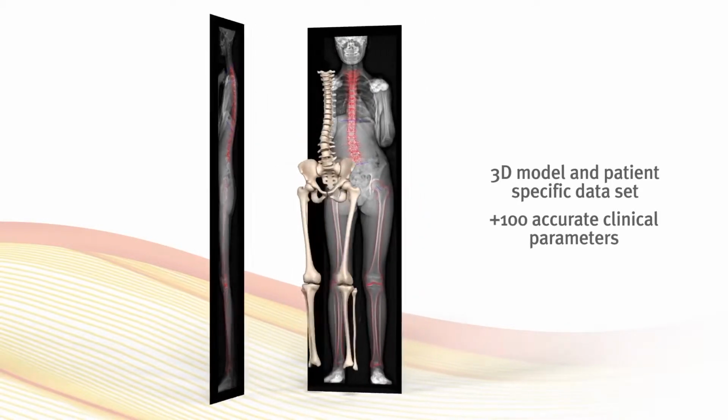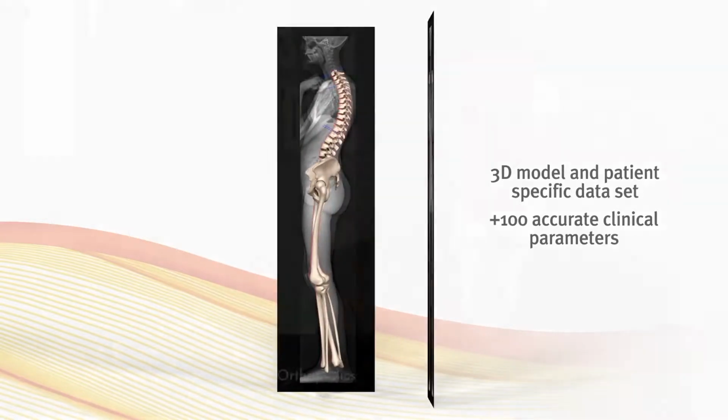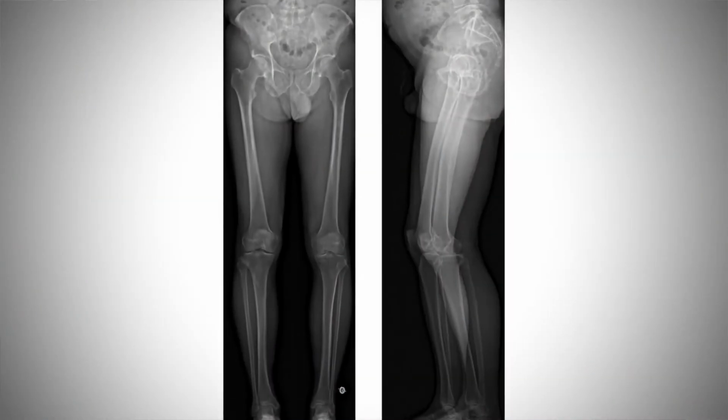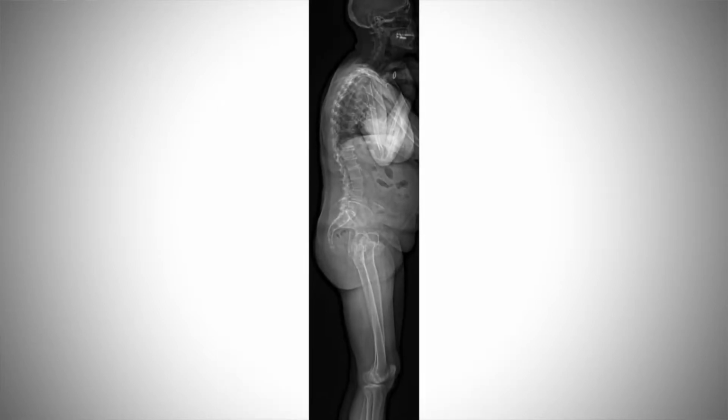But when trying to see how this would be useful for a large subspecialty orthopedic group, it takes a little bit of looking into. And what we found is that the applications for EOS aren't just limited to pediatric spinal deformity. In the adult spinal deformity world, we know that often patients have arthritis of their hips and their knees, and that affects how they stand. So the x-ray that you get of a patient's spine standing up may only give you part of the story if you don't have the ability to scan their whole body. And we've seen our spine surgeons actually change how they approach the surgical management of those patients and get much better results. And then it goes into the world of adult reconstruction.